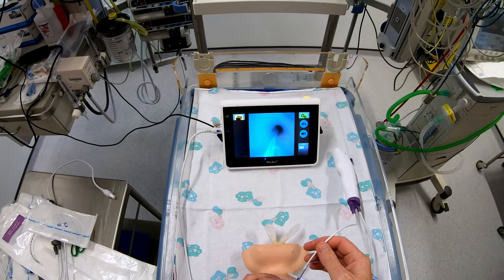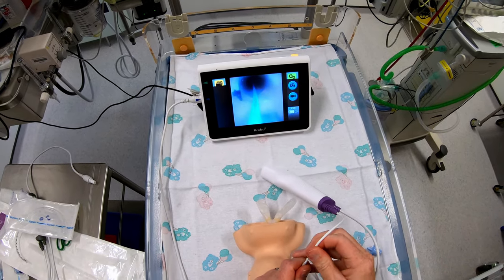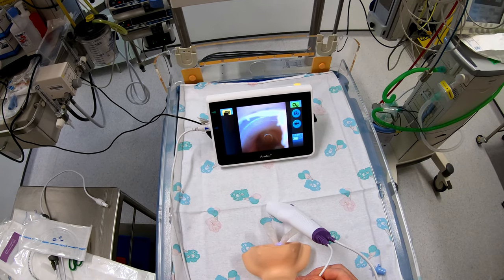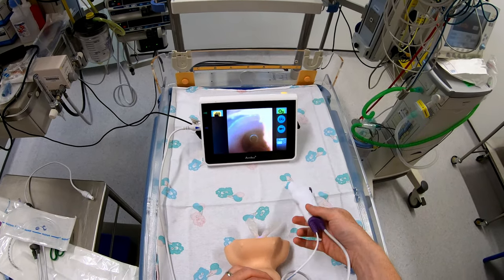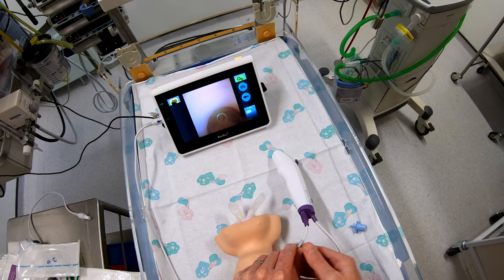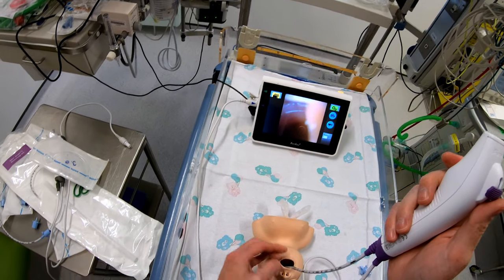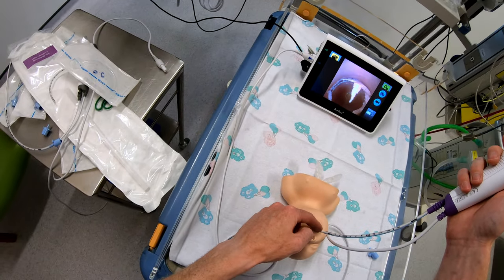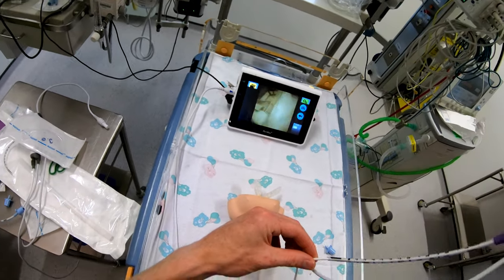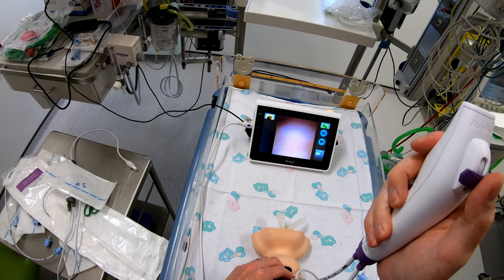So if the scope is placed with the tip at the carina, you can see at the mouth there's really only about a centimetre of space to manipulate the tube. It does seem to be a little short in length, and when we come to the nose that should be even more of a problem, because the nose normally adds about a centimetre in most patients of this size.